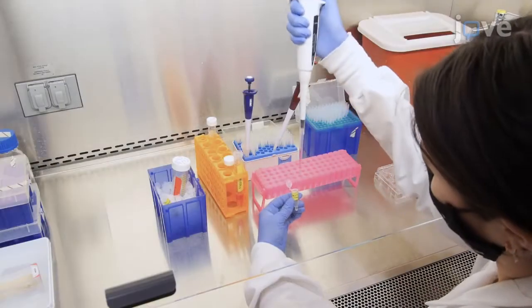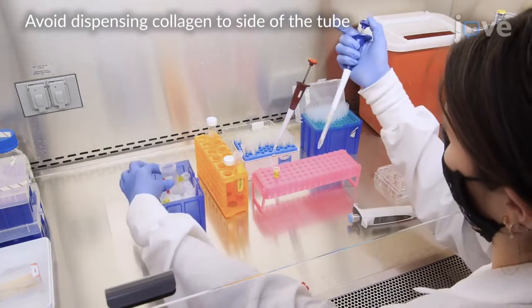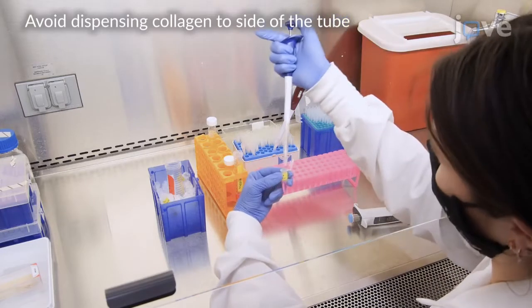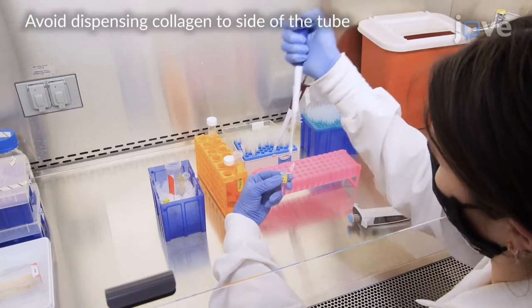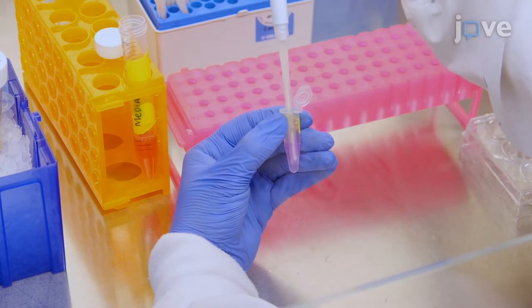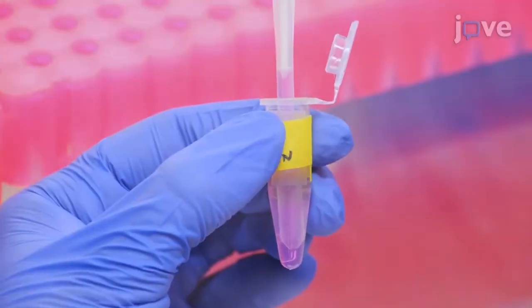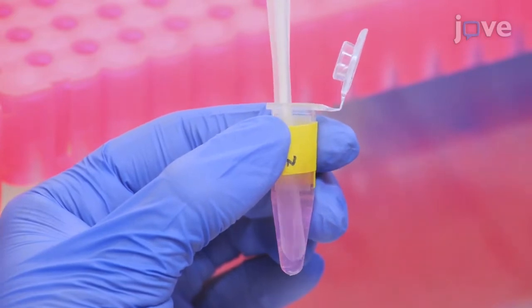To begin, add 516 microliters of media to a cold cap tube and immediately add 375 microliters of cold collagen using the 1000 microliter positive displacement pipette. Remove the empty pipette tip and switch to the prepared 250 microliter positive displacement pipette to mix. Mix quickly but gently to prevent excess bubble formation, keeping the tip in the solution.